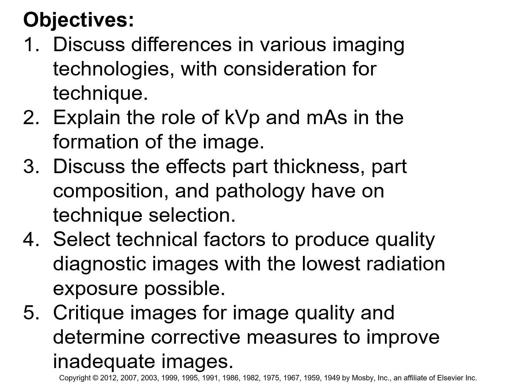People taking pictures of butterflies or hummingbirds know they have to have a quick shutter speed, a short exposure time that is, in order to remove blur and capture that flying creature as if it's hovering in the air, frozen in place. Okay, we can do the same thing with a 2-year-old with an attitude problem.